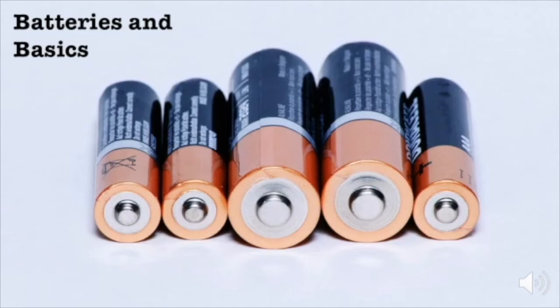Now, common sense would make you think there'd be a bunch of spare batteries sitting around the hospital, but you know how difficult it is to even find a spare pillow in the ER, so assuming the hospital will have LVAD batteries or a charger is a dangerous assumption.